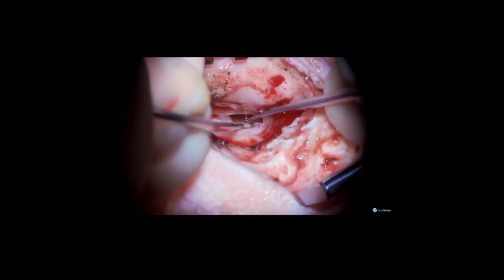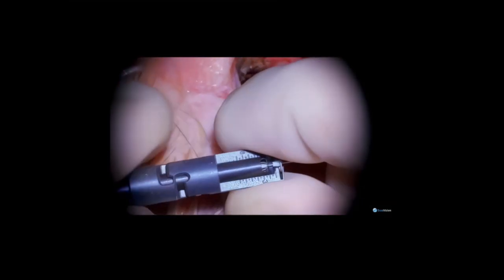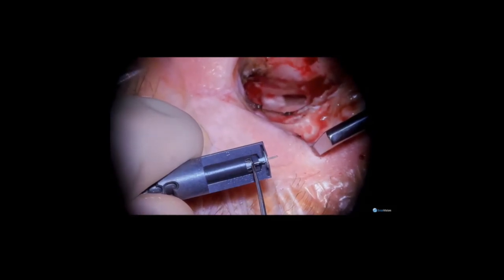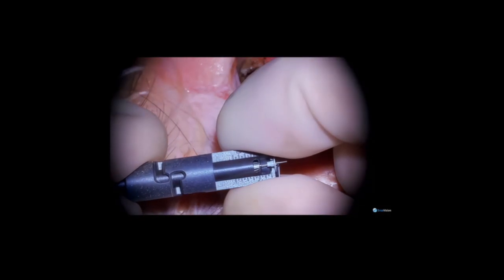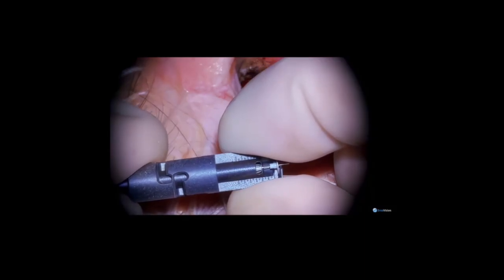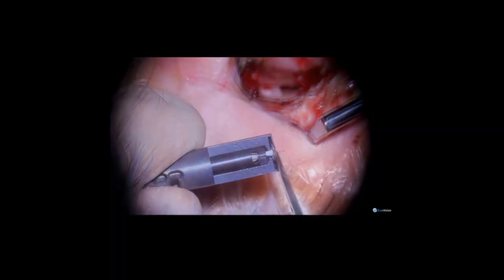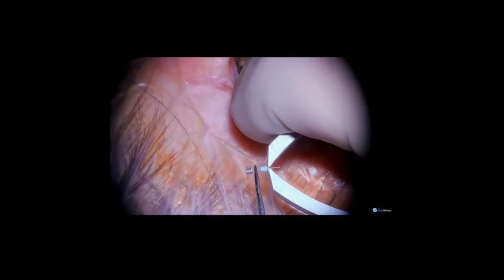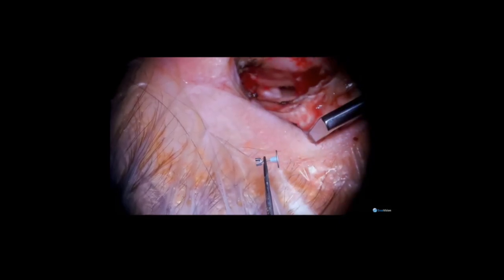I am estimating the distance and the tension that I need to place the prosthesis between the superstructure of the stapes and the undersurface of the new eardrum. I use an Alto-style adjustable prosthesis made by Grace Medical because I can expand it even once it is in place in the middle ear. Using the angled picks, I am estimating the size that I need to cut the prosthesis. The prosthesis has small ball notches that slide through a Teflon sheath in order to adjust the size.